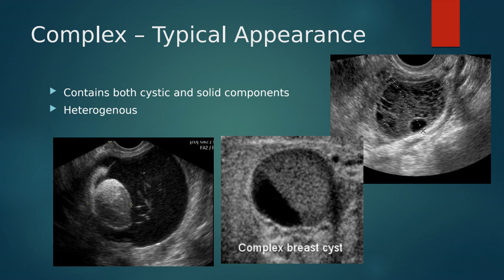serious going on. And here on the right-hand side, this is our picture of an ovary. So this is our ovary. Here's our ovarian border. And then there are our multiple cystic follicles inside that ovary. Both of these two images here are complex mass findings. So both of these are worrisome. And this terminology, that should not say cyst, because like we said, anything complex is no longer just a cyst.